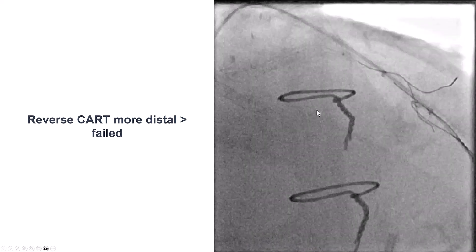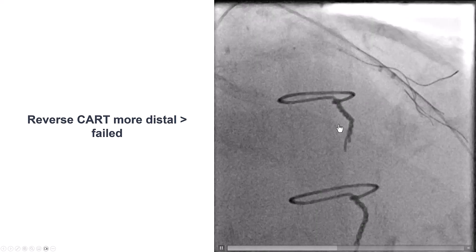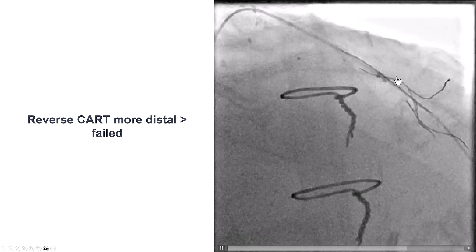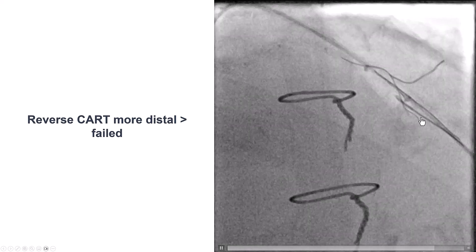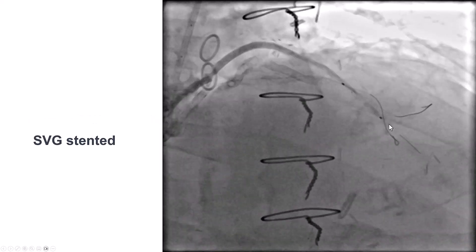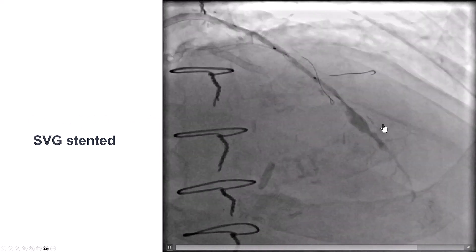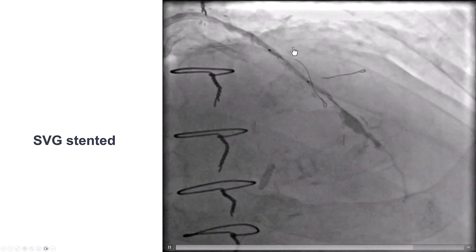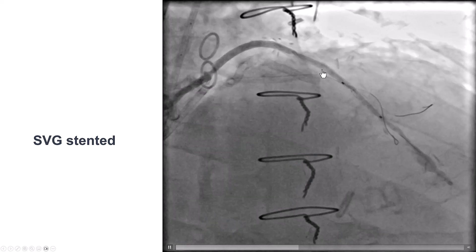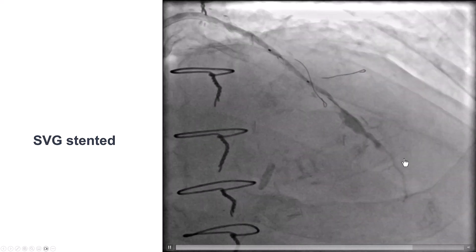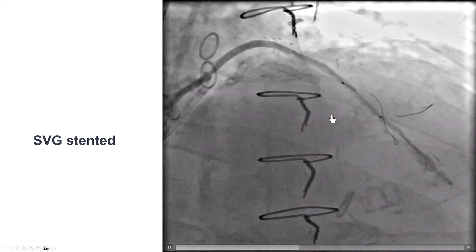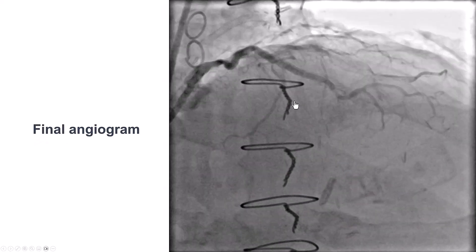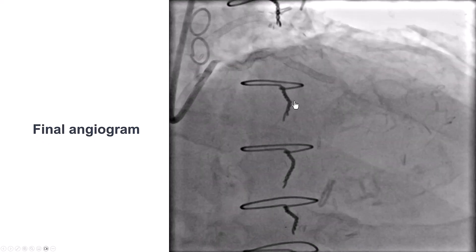After multiple attempts, we finally gave up on the wire position and decided to try to recross at a different location that might be less likely to be microcatheter uncrossable. We tried different locations but were unable to get through. Due to contrast and radiation concerns, we decided to stop the procedure. However, we did have flow coming from the vein graft, so we placed a stent in the proximal part of the vein graft. We did not stent the distal part, preserving the option of going retrograde again, with the plan to bring the patient back to attempt recanalization of the native LAD CTO.